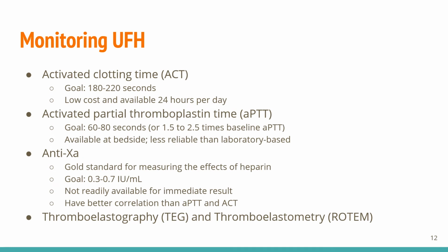First, I want to talk about ACT. It's a whole blood point of care test where blood is mixed with an activator to provide a global functional test of hemostasis. The goal is between 180 to 220 seconds. It is low cost and readily available.